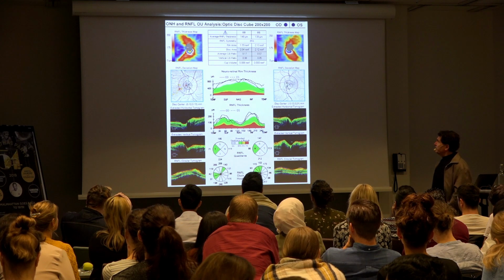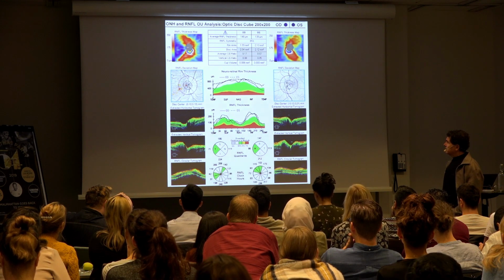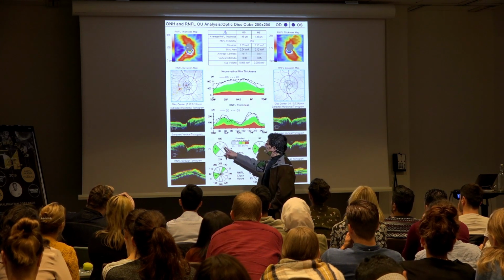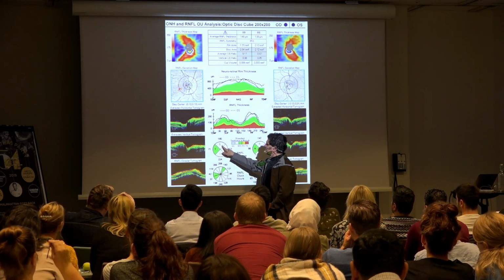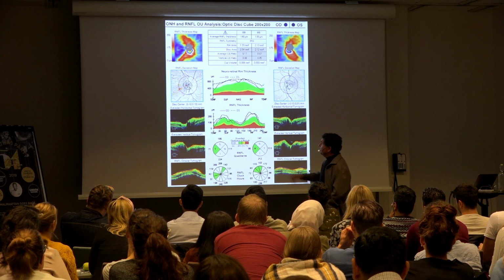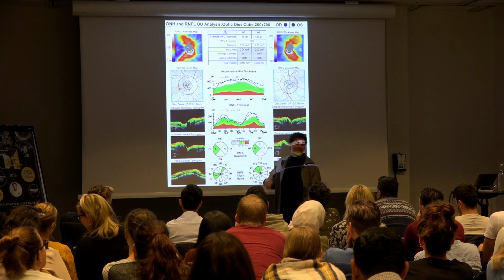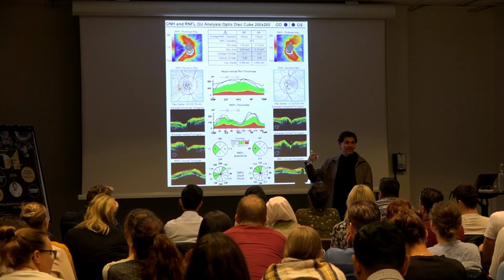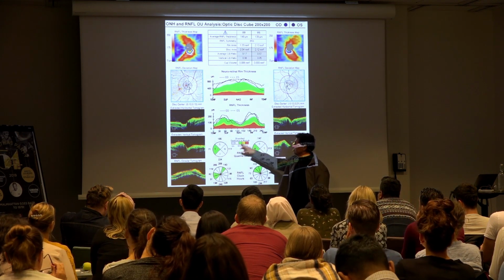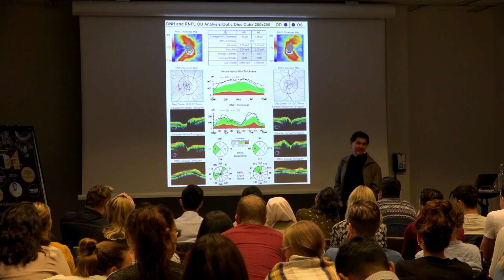And with the retinal nerve fiber layer plot, would you say that's normal or abnormal? What does it mean when these are white? You know, before they were all green. It means it's thicker than normal. So if it's above the green, then they make it white. That means it's above the 95th percentile. If it's yellow, it's below the 5th percentile. So here they got it for you right here. That means it's thicker than normal. We already said it looked edematous, so that's not really anything you didn't know.